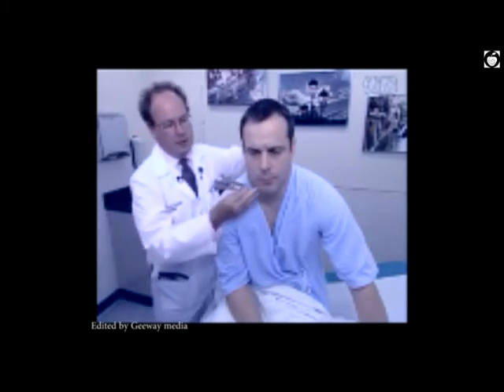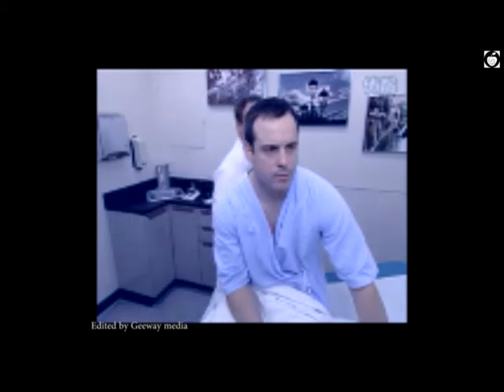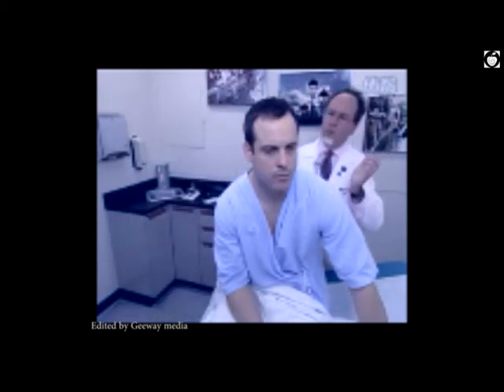Strike the tuning fork by placing it into oscillation by striking the heel of your hand and then placing the vibrating tuning fork on the mastoid process of the patient. Mr. Johnson, do you hear or feel anything? Yes. Okay, tell me when you stop hearing it or feeling it. It stops. Okay, what about now? I can hear it. Okay, so air conduction is greater than bone conduction, and that's normal. AC greater than BC. The examination is conducted in the other ear as well.